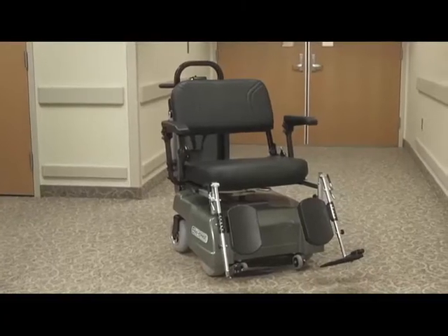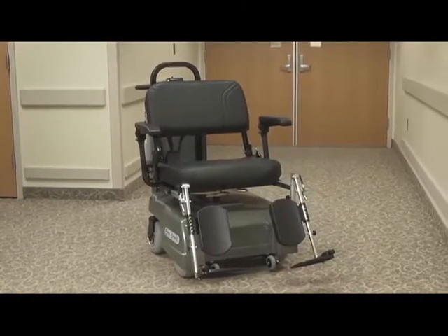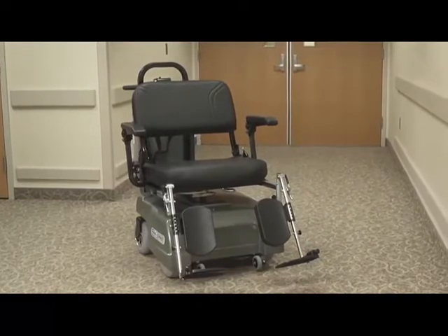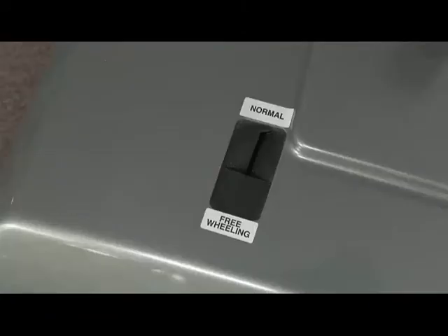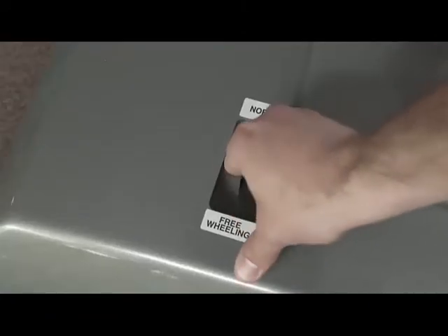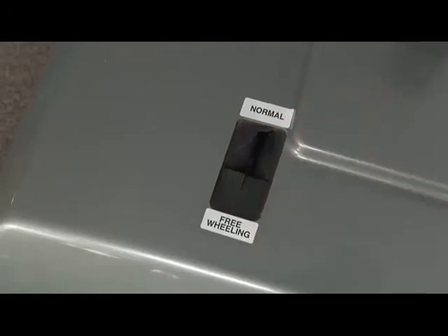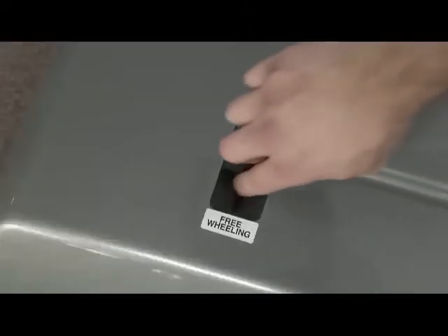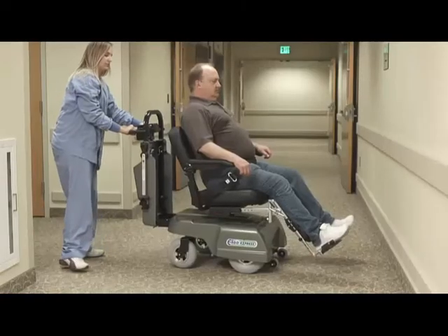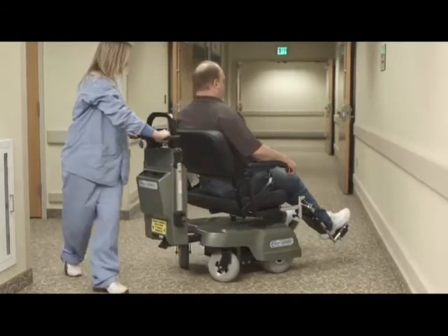When the PTC must be moved while electrical power is unavailable or if disabled, perform the following procedure. Turn the key switch to the off position. Locate the brake disengagement lever under the seat. Disengage the brake by rotating the brake lever about 20 degrees. Do not release the brake when the PTC is located on an incline. The lever should be hand-operated only — operating it in any other way could damage the brake. Once the brake is off, you can manually push your PTC.